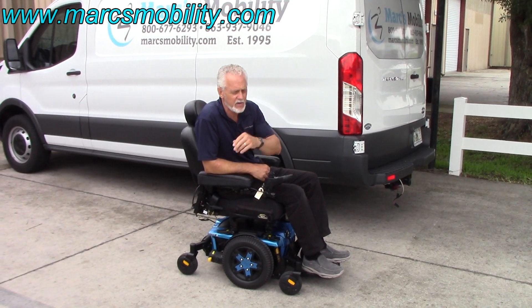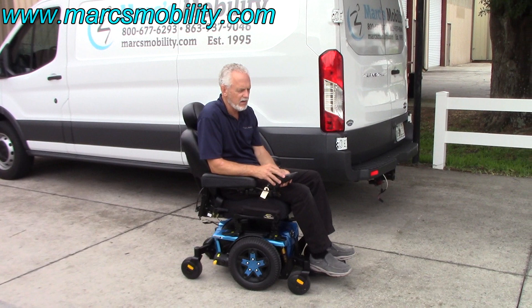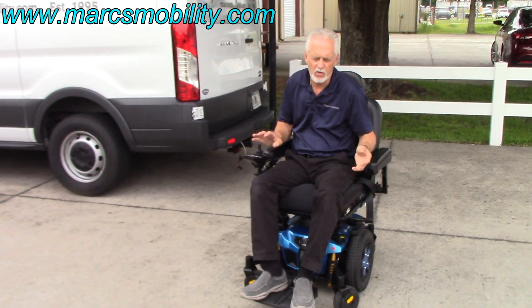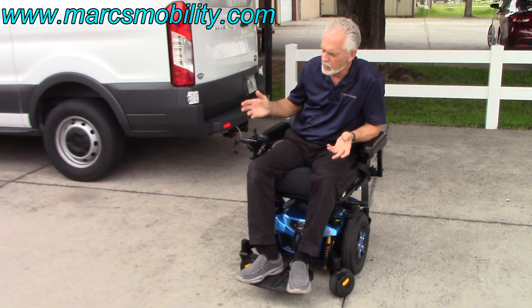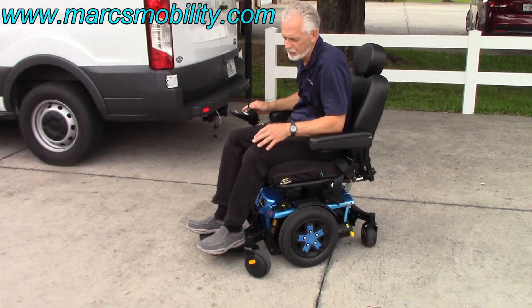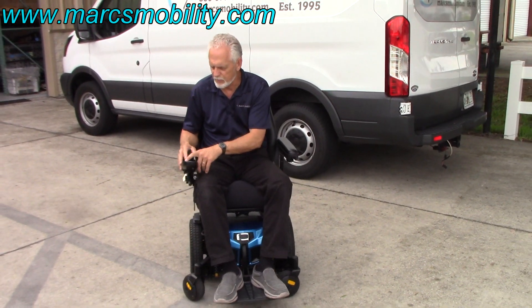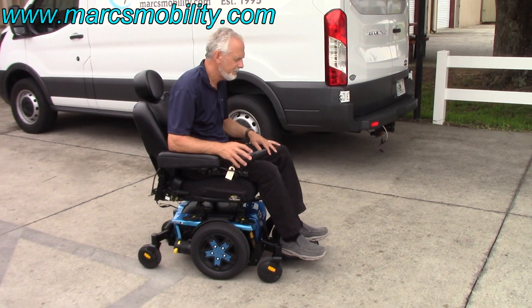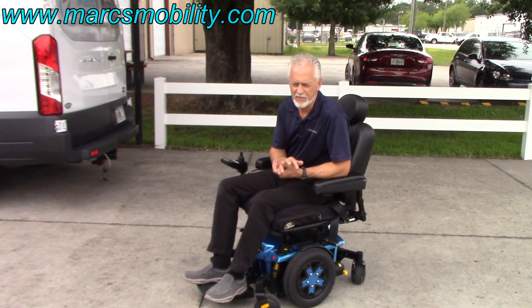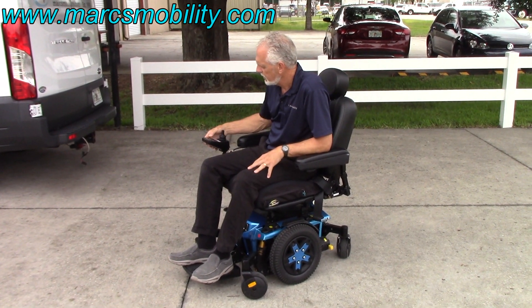Six miles an hour top speed. It's very easy to drive — I had it on full speed. If you put it on speed number one it barely moves, and it's very easy to drive with no real response. Going from speed one to six takes you from almost not moving to six miles an hour. Speed number two would be your learning speed. When you get up to speed number five that's when you're going to hit six miles an hour. The joystick responds gradually, making it a fantastic chair to drive.